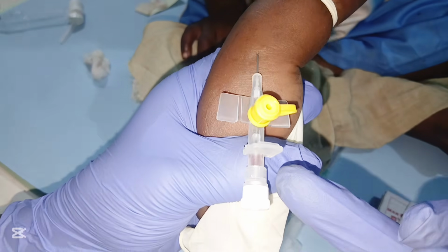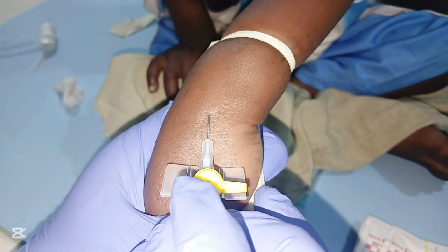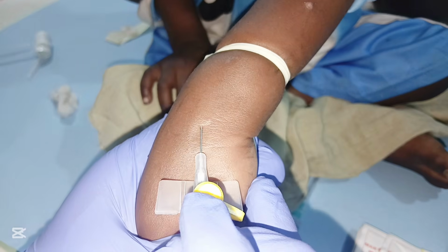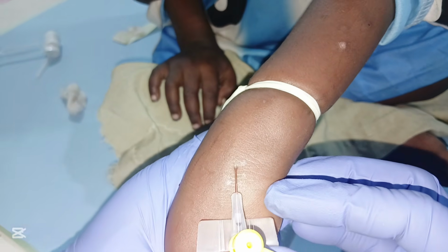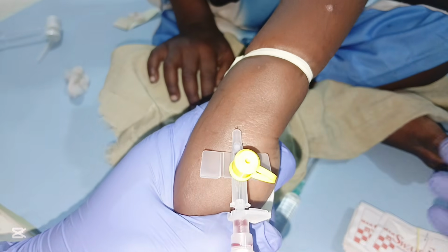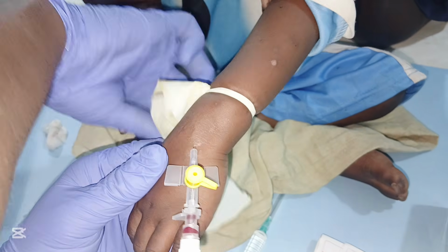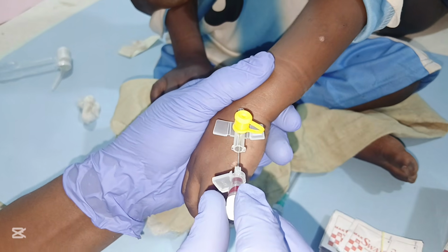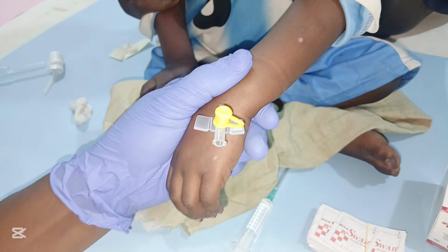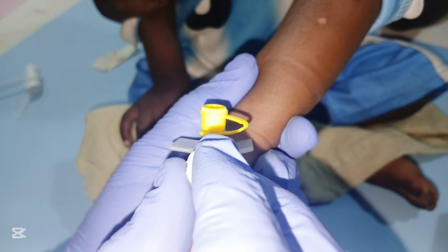You can see there is a flashback in the flash chamber of the cannula. So you slightly pull back the needle. Then there is a secondary flashback. Then you advance the cannula deep into the vein. You release the tourniquet. Then you completely remove the needle from the cannula. Make sure you cap the cannula.